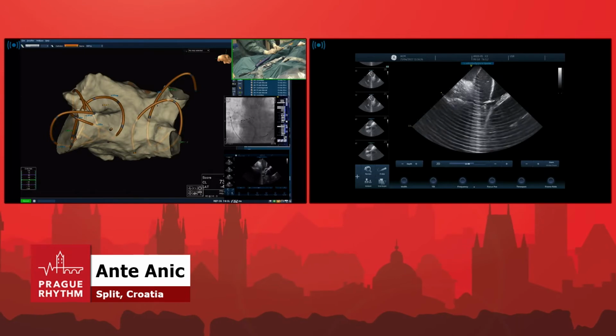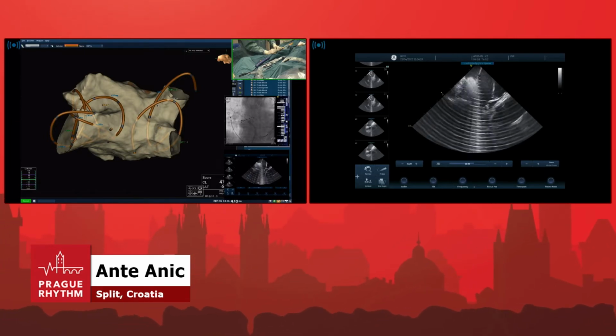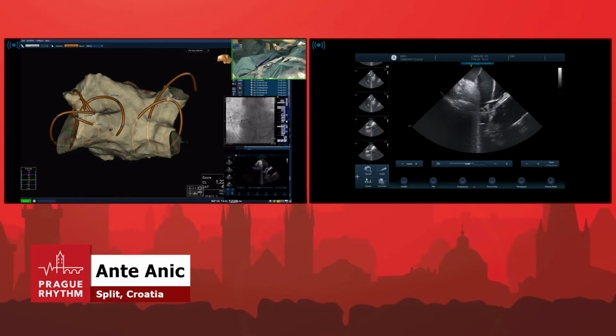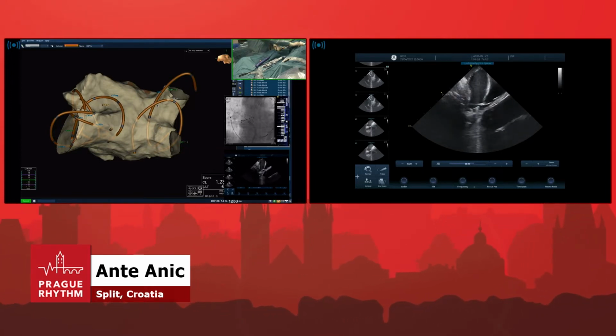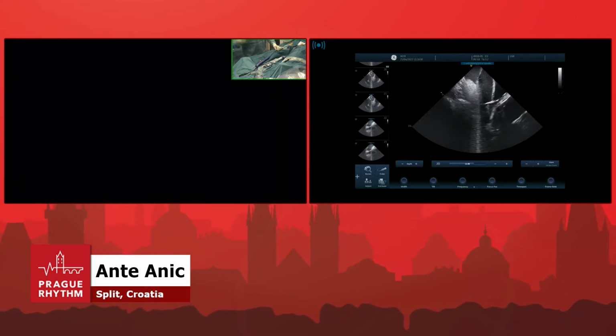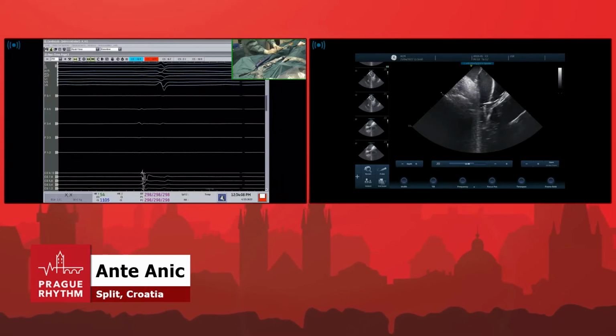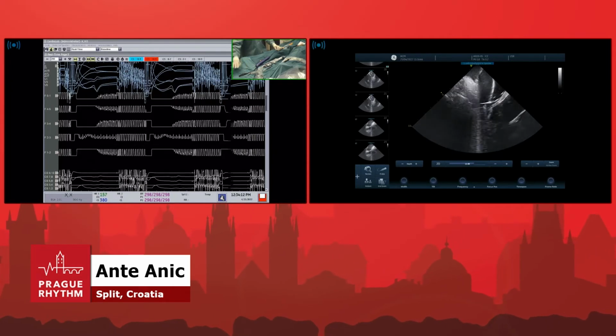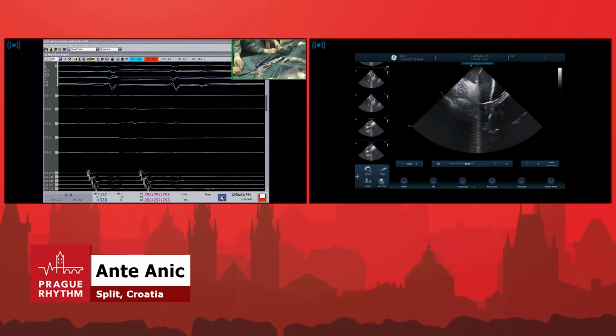And this is anteriorly and superiorly directed application. Can we see signals on the main screen? There are no signals actually. Yeah. Well, before you apply, right superior PV. So what I'm going to do now, keep the wire. So this was the first set of lesions.